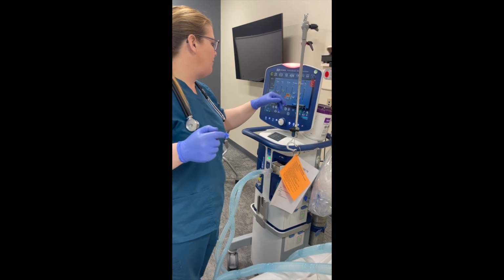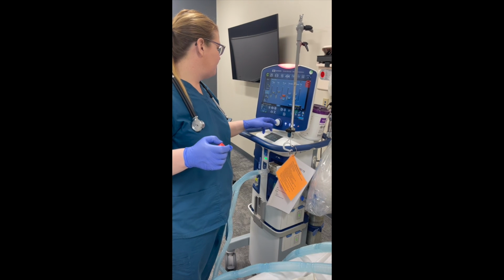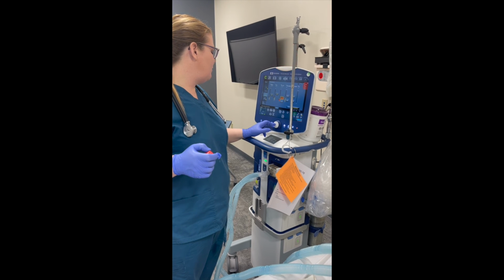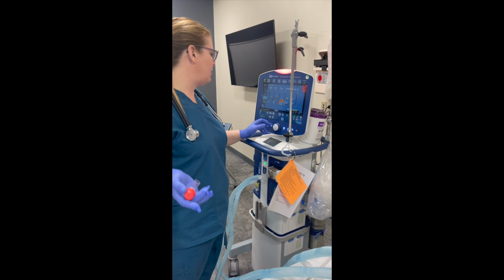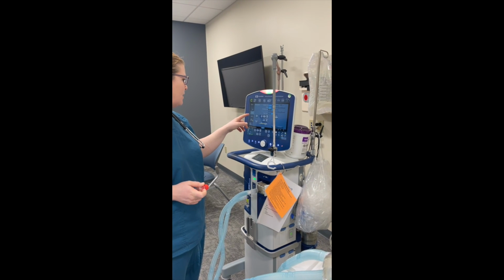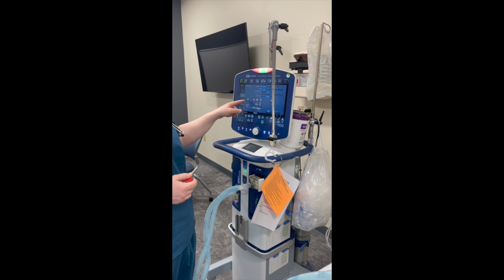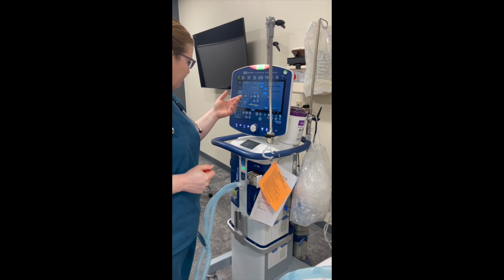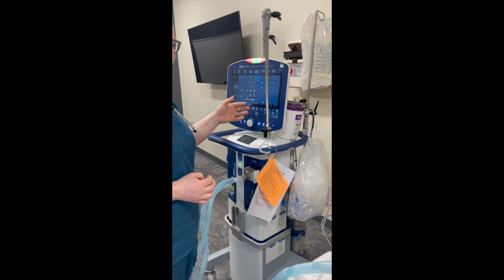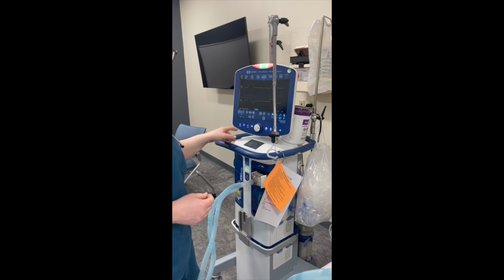So right now we're at 7.9. So I'm gonna go ahead and adjust this. We can only go 8.5 or 9, so we're gonna go ahead and keep it at 9. So for our apnea setting, we want 20 seconds. And then everything else looks good for our apnea settings. So we'll just go ahead and close this out. All right.